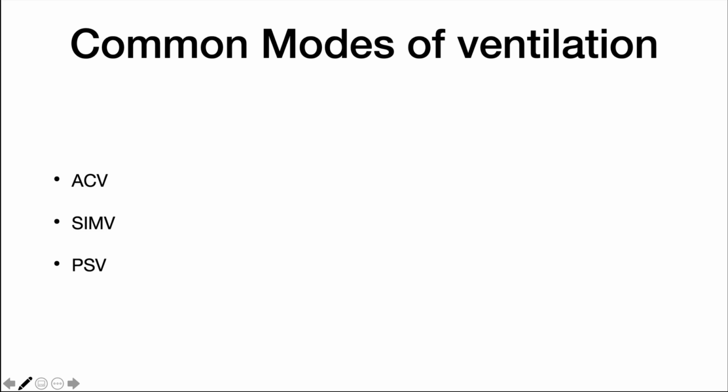The choice of mode of mechanical ventilation is most often determined by whether resting of the respiratory muscles is indicated, such as the patient who is hemodynamically compromised, patients with severe oxygenation or ventilation derangements, or those undergoing general endotracheal anaesthesia. In these cases, such as in the pre-hospital environment, most patients will be RSI'd and hence require a mode of ventilation that accomplishes ventilation without the need for spontaneous respirations, so ACV is often the most commonly used mode.